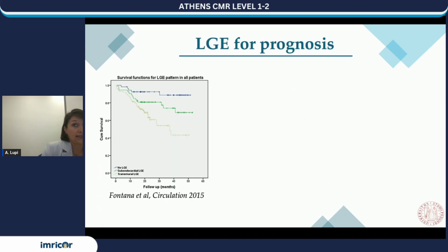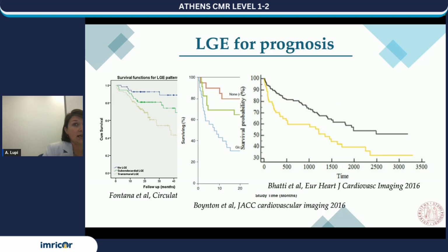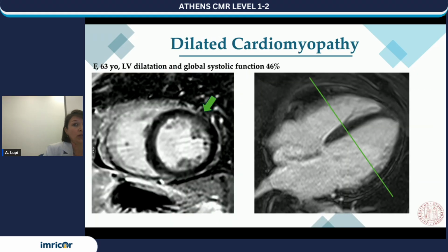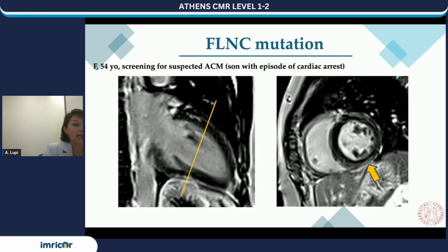Nonetheless, available data consistently underscore the prognostic significance of late gadolinium enhancement in these pathologies. For these reasons, the new guidelines emphasize that this is not only well known in entities such as dilated cardiomyopathy, but also now in various genetic and acquired disorders that present with intermediate phenotypes, where the presence of scar becomes essential for disease classification.